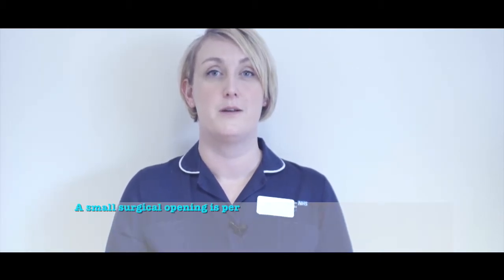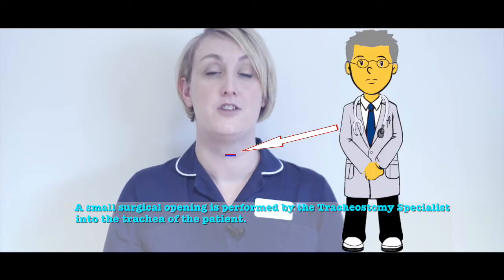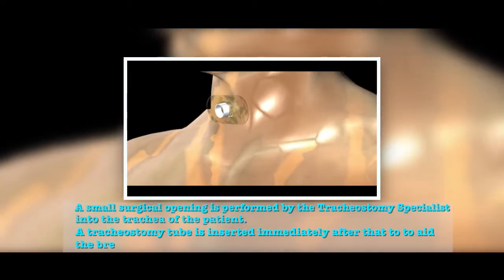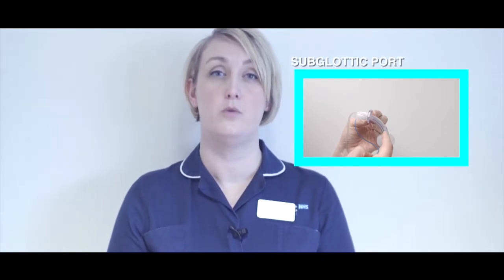A small surgical opening is performed by a tracheostomy specialist into the trachea of the patient. A tracheostomy tube is inserted immediately into the opening and secured in place. A tracheostomy tube is made up of an outer tube, an inner tube, a flange, and it may or may not have a cuff depending on the reasoning for the tracheostomy tube, and a subglottic port to aid removal of secretions collected on the cuff, though this is not present on all tracheostomy tubes.